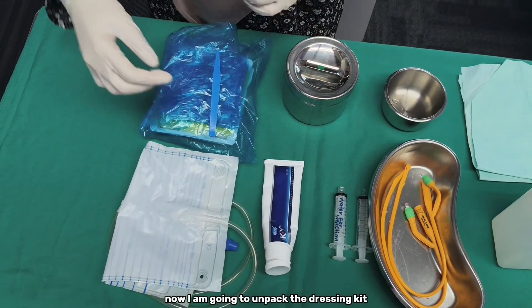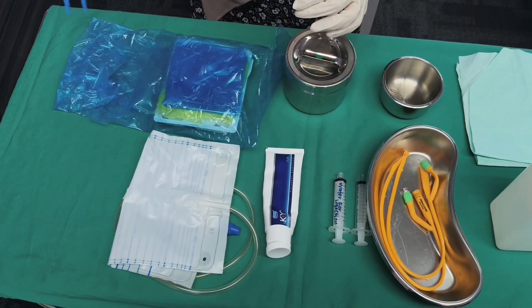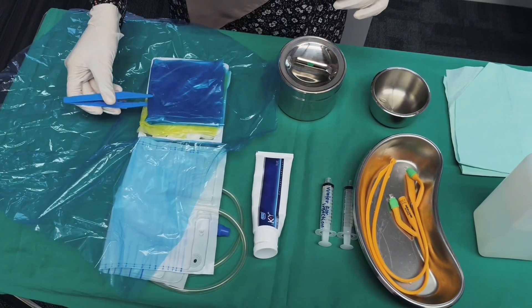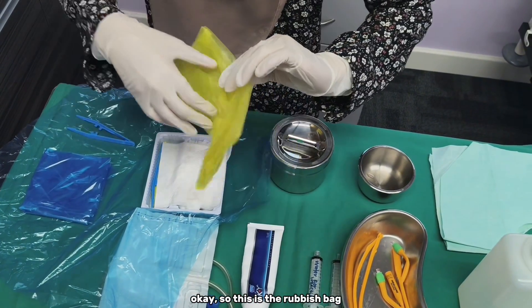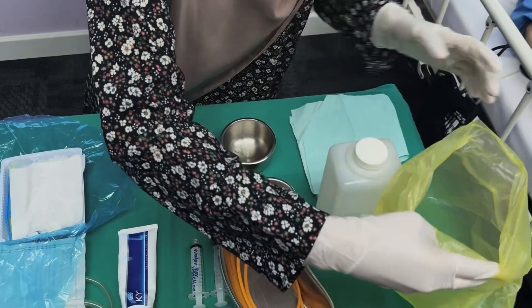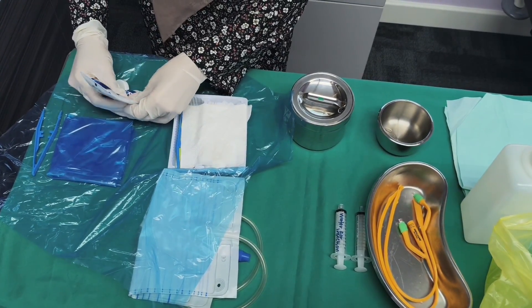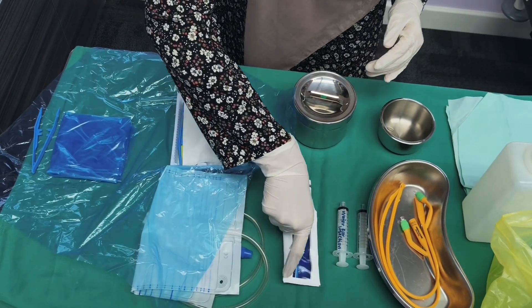I am going to unpack the dressing kit. This is the rubbish bag — I am going to put it outside. Now I am going to put the gel. Okay, I am going to pour the water.